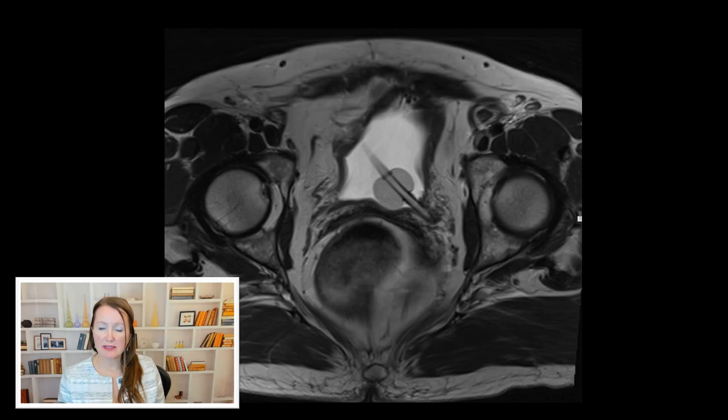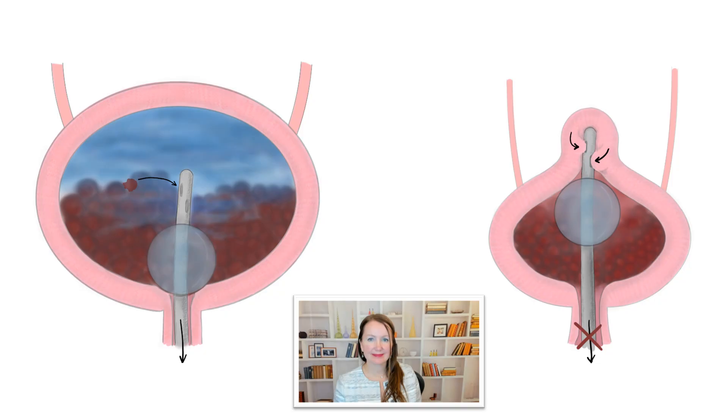If the catheter is pushed far into the bladder or into clots, the drainage ports may not be able to drain. On the left, you see the catheter tip drainage ports are able to access a free area within the bladder, and when irrigation is pulled out, clots can be removed. On the right, however, the bladder is not full enough and the catheter tip is pushed in, so when one tries to remove fluid, the tip of the catheter is just suctioning the bladder wall.